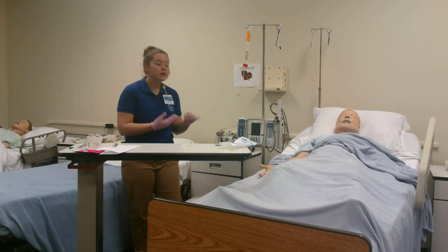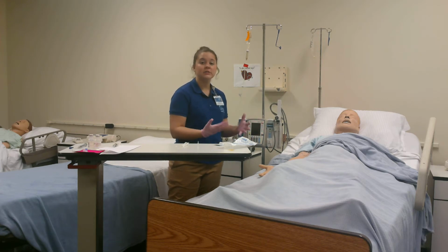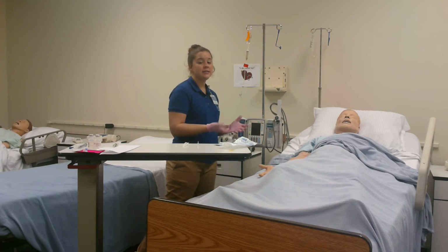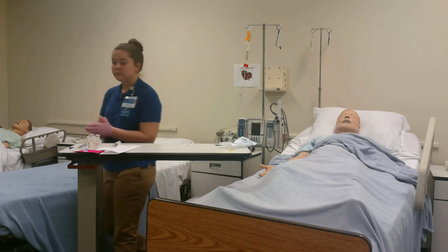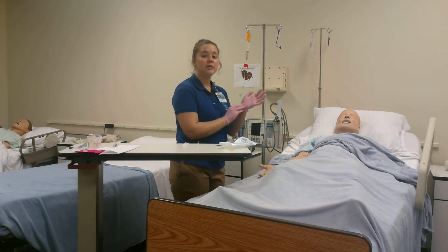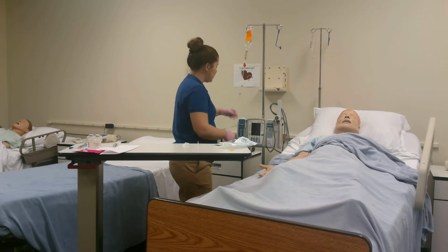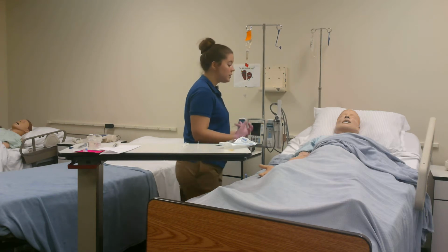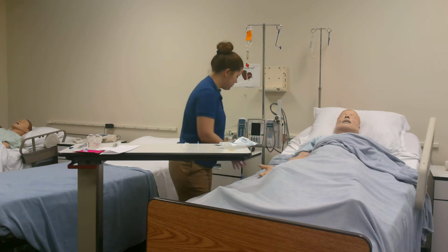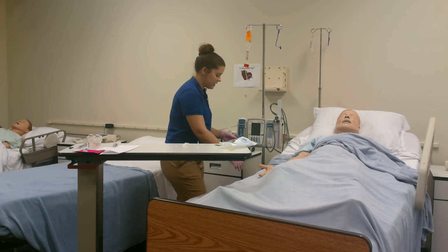Okay, and I would check on Mr. Jackson periodically and look at his IV site and make sure that he feels well, and monitor his blood pressure and any signs of nausea and vomiting. So I would then leave the room, come back, wash my hands, put on my gloves. Mr. Jackson, it appears that your medication is complete, so we're going to go ahead and complete our procedure, and we're going to clamp our tubing so that it comes out.